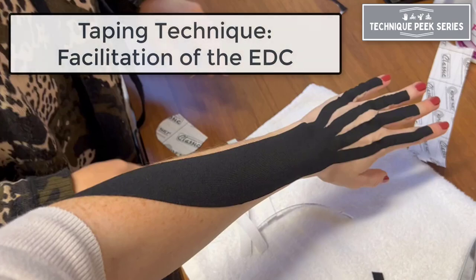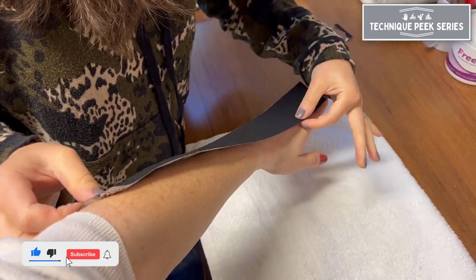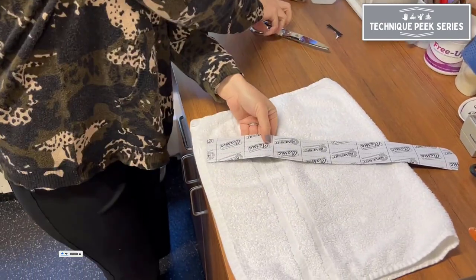Today we're going to demonstrate taping application for facilitation of the extensor digitorum communis. We're going to start by measuring the length of the tape from the lateral epicondyle to the tips of the fingers.